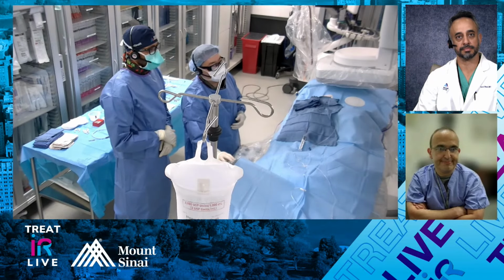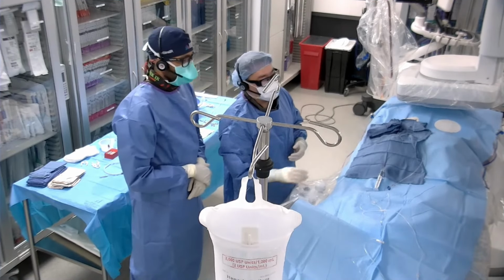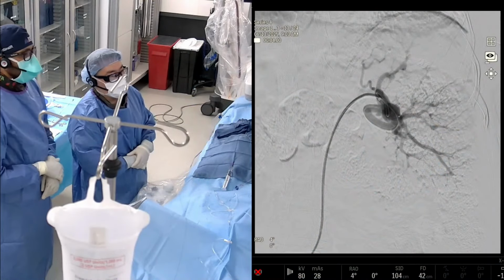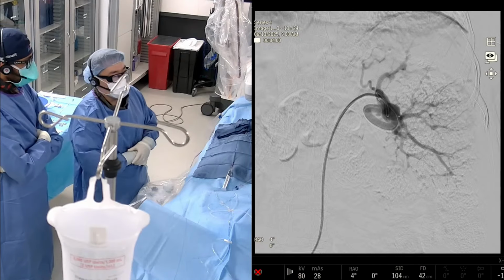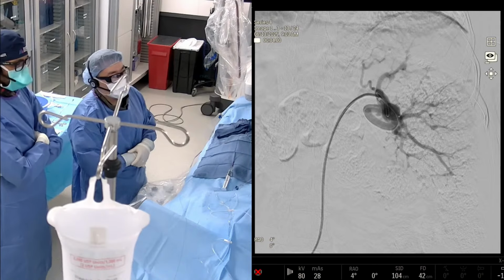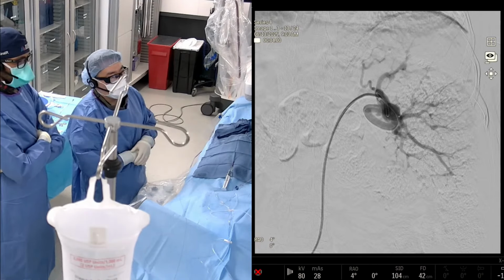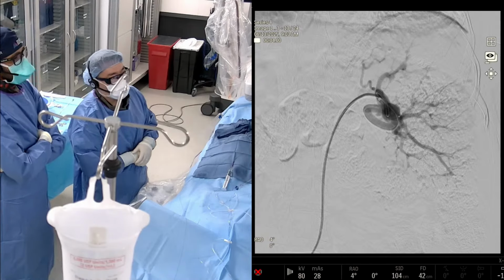We went from a femoral access. In terms of our equipment, we have a 6 French guide, the Catapult, with an MPA angle to it, and that's when we looked at the cross-sectional imaging ahead of time. We felt the MPA with a slight angle would be favorable for us to seat that MPA guide into the proximal splenic artery.